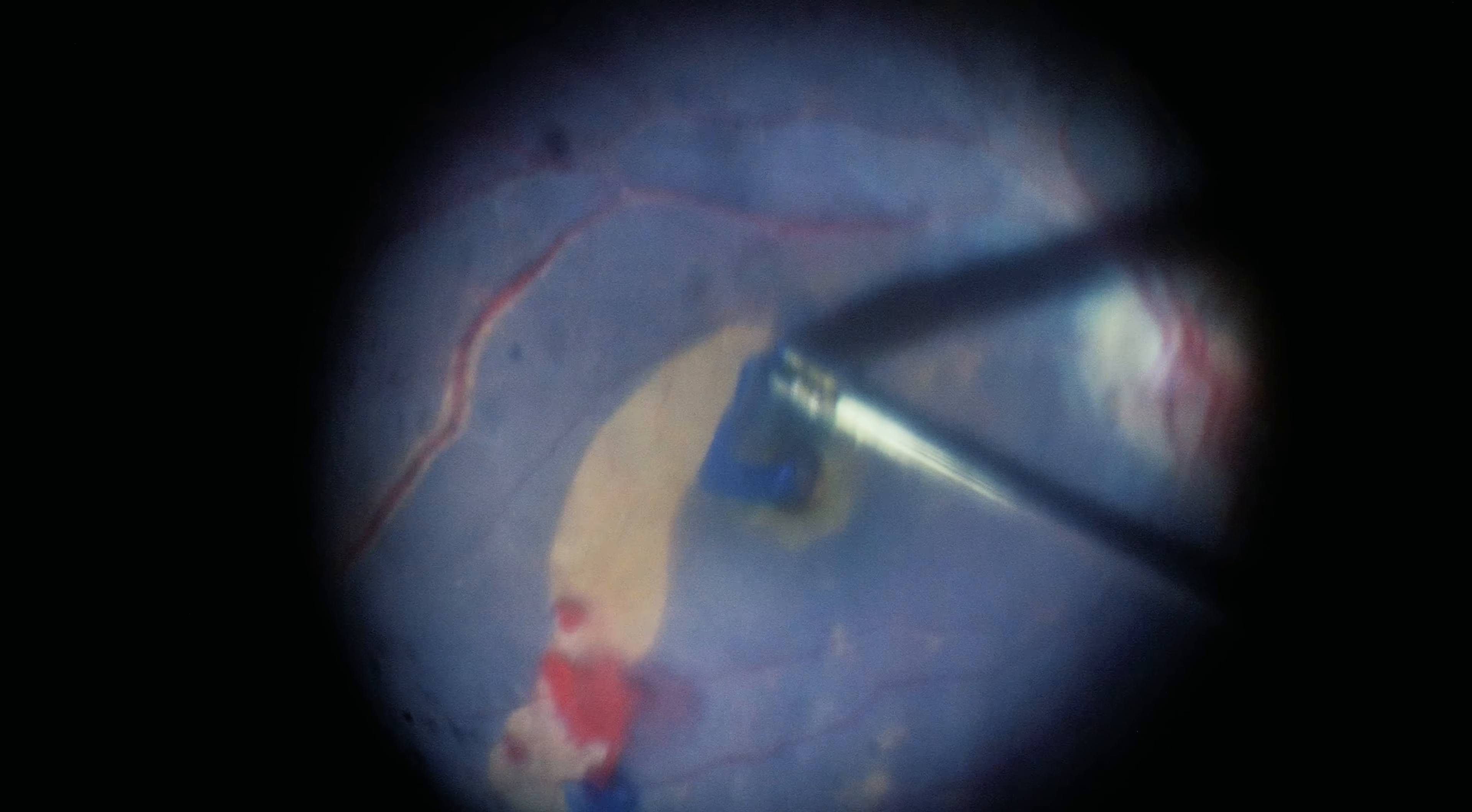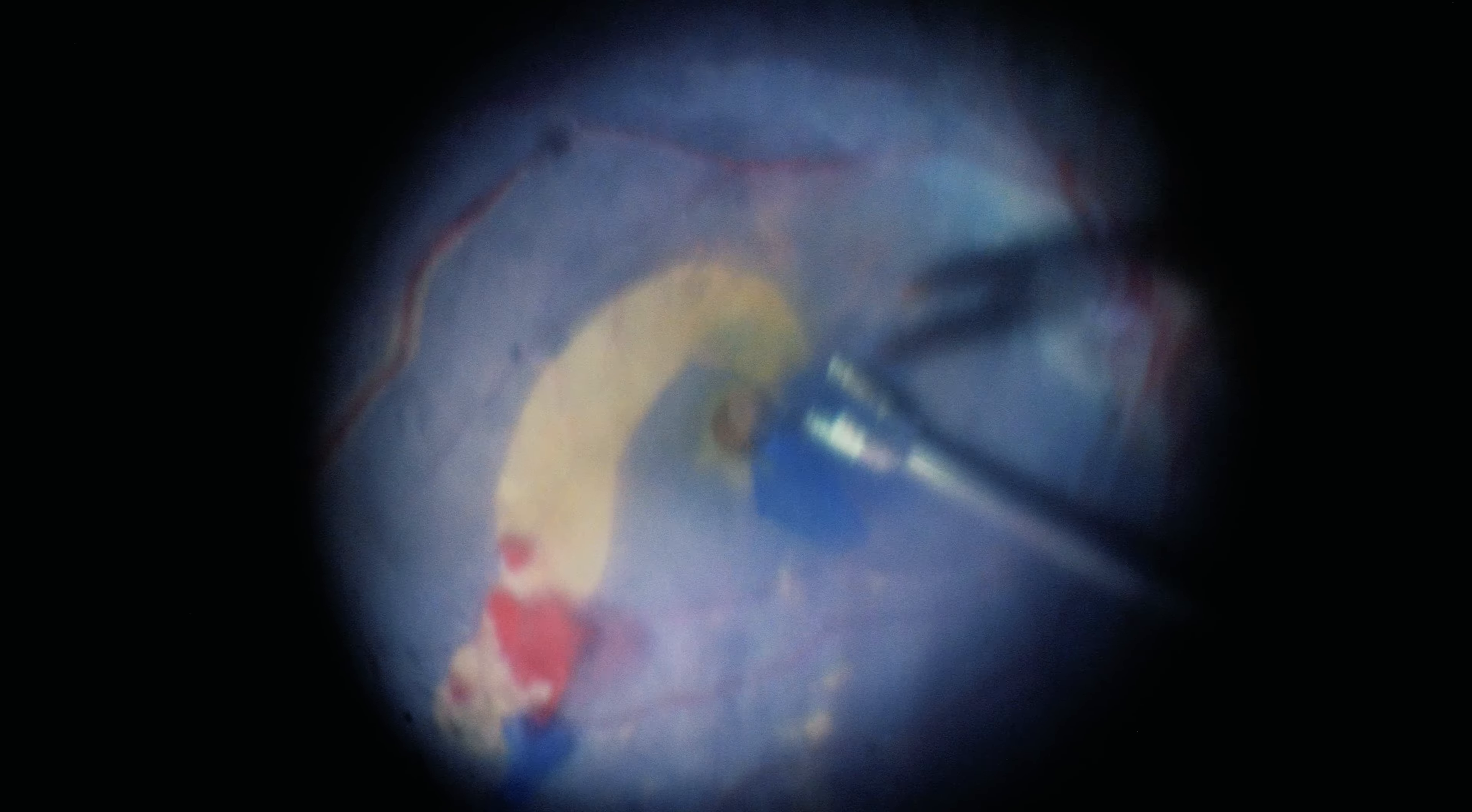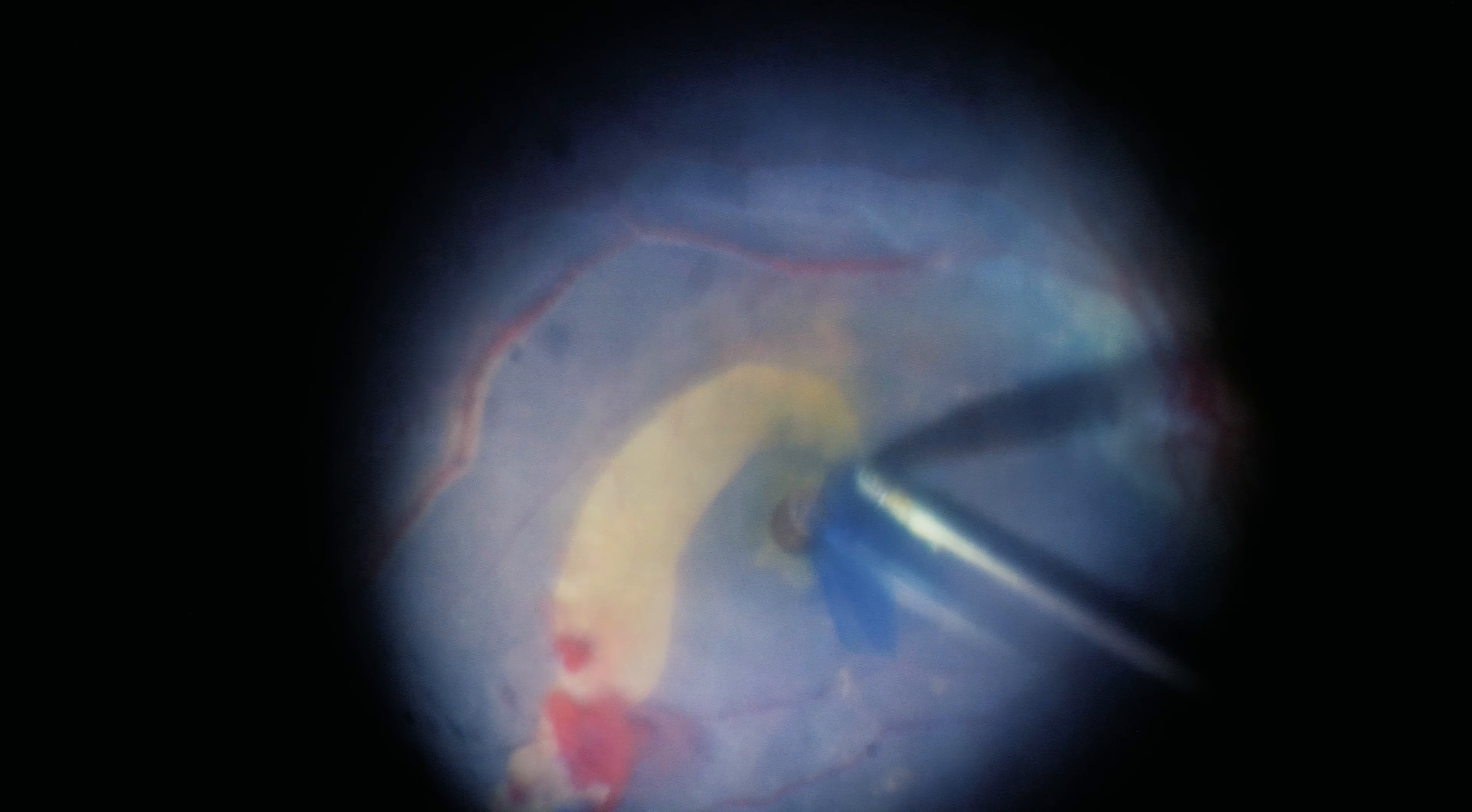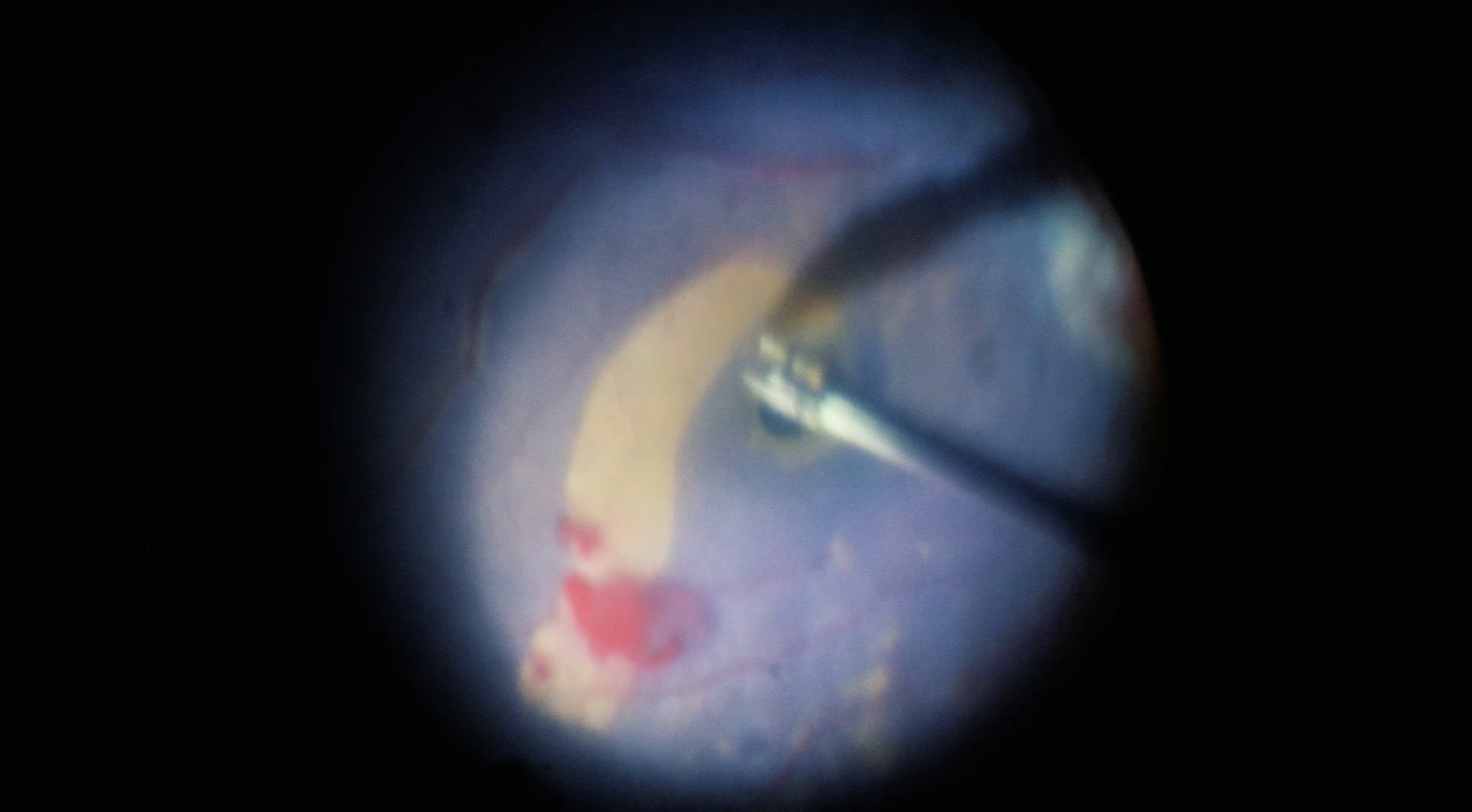The peeling was carried out in a clockwise direction and part of the ILM was stuffed into the hole. Interestingly, in an attempt to extend the peeling, even though slowly enough, the plugged-in material came out with the ILM on and around the top of the hole when it was removed.